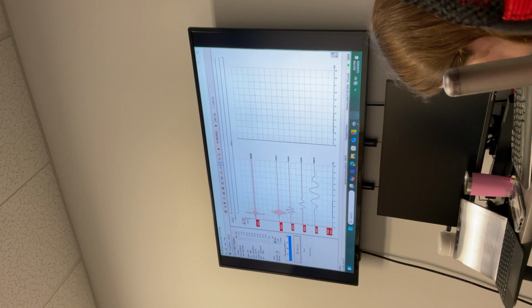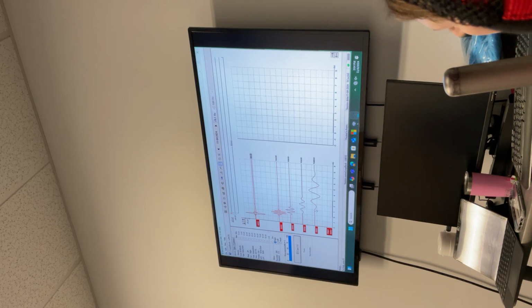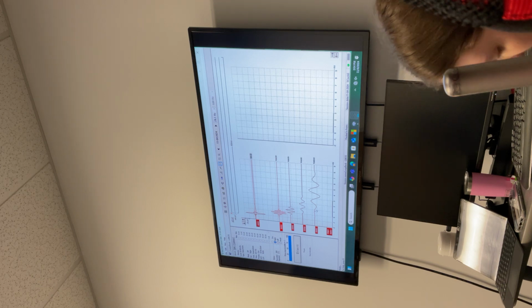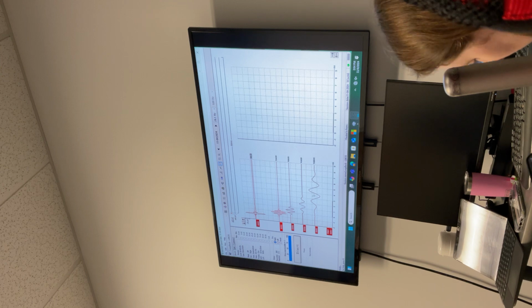You can see at 500 hertz, the response is so poor because ABR is an onset response. ABR is all about rise time, how the energy is going out. For 500 hertz, it's taking so much time to reach the peak energy, the response is not synchronized.